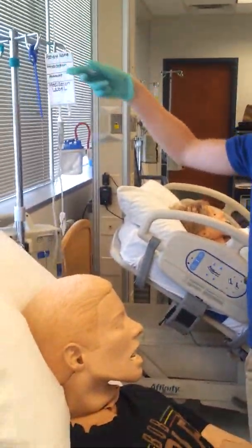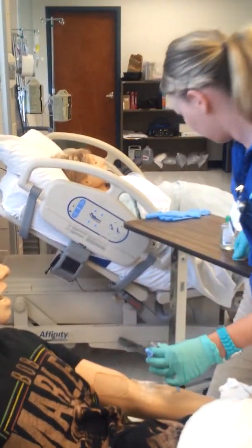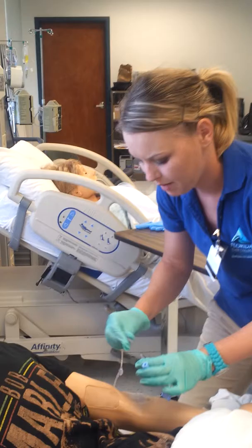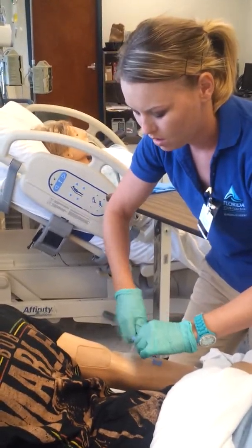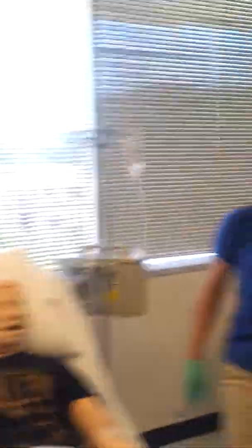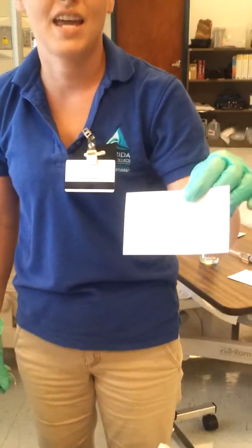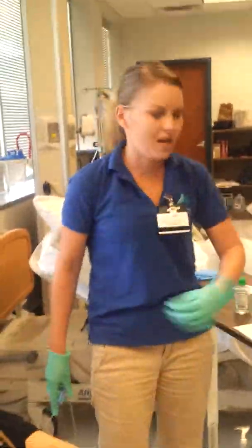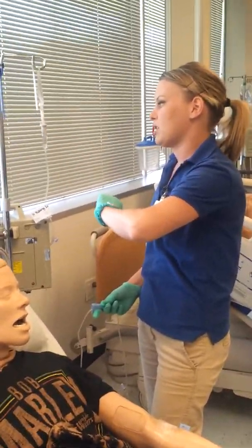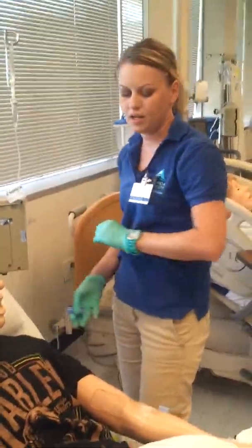Then I'm going to get my IV medication. I'm going to clean the port again. I'm going to clamp the primary line, unscrew the cap, and connect this to my patient's IV. Then I'm going to open the IV and come over to my rollerball. It was 100 milliliters over 60 minutes, and the drop factor on my IV tubing was 10, so the drop factor will be 17 drops per minute. I'm going to watch my chamber and move my rollerball until I get approximately 17 drops per minute. So that's running at 17 drops per minute like it needs to.